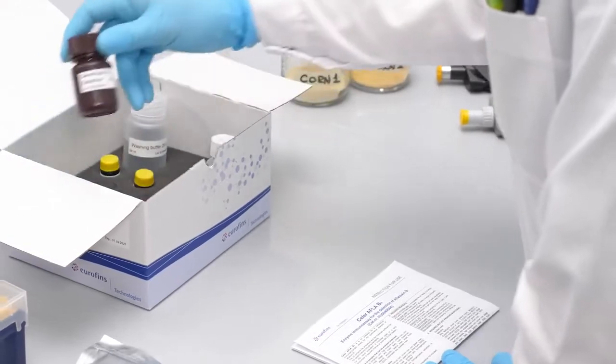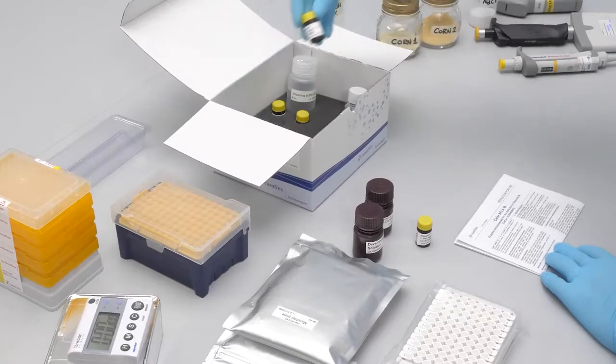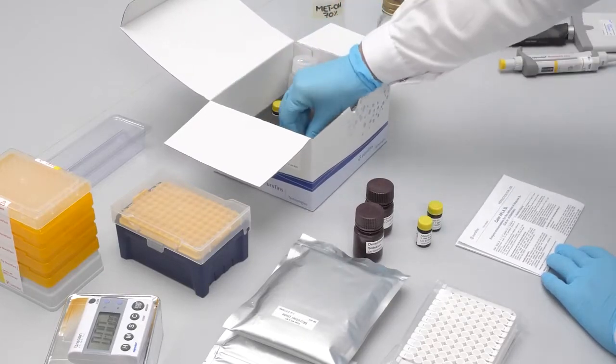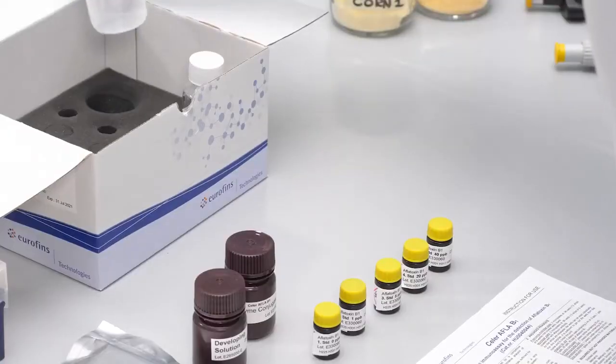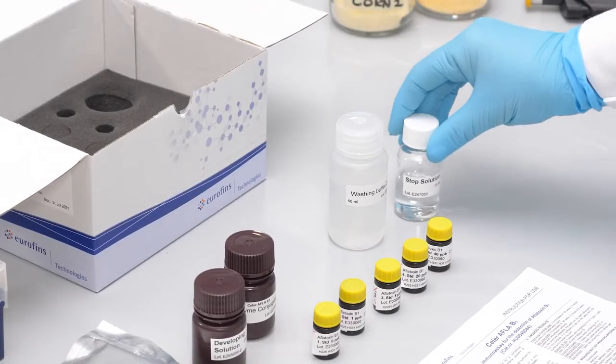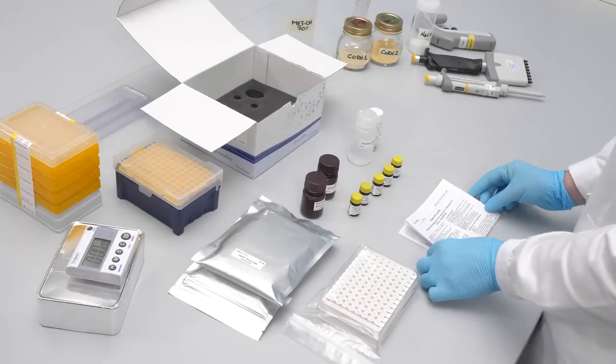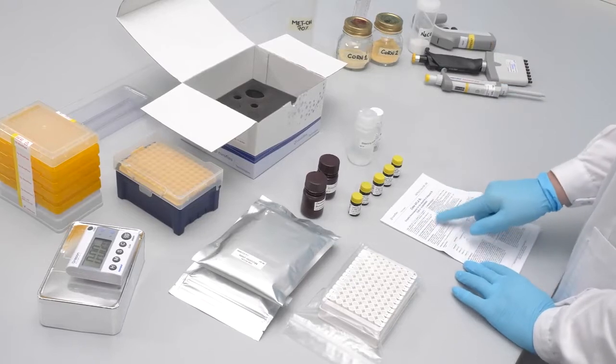The test kit has been validated for the analysis of maize, high moisture maize, sorghum, brown rice, mash, corn gluten meal, silages, feed, hazelnuts, pistachios, peanuts, almonds, raisins, figs, DDGS, cottonseed, soy and soybean meal.